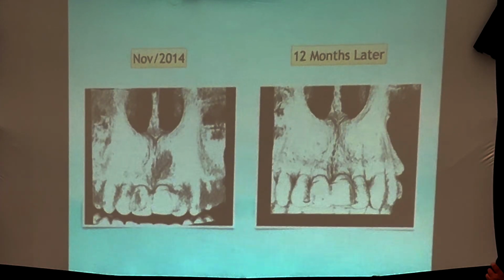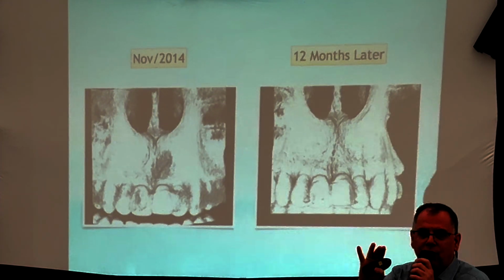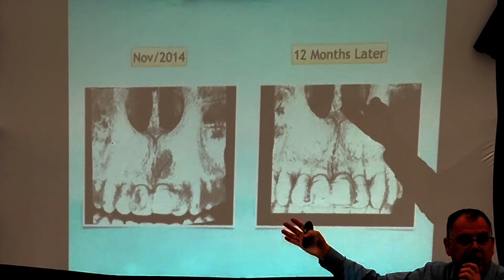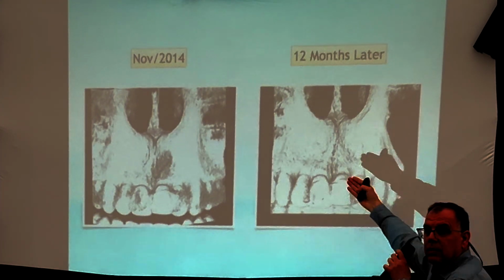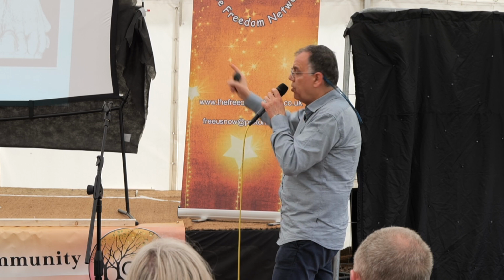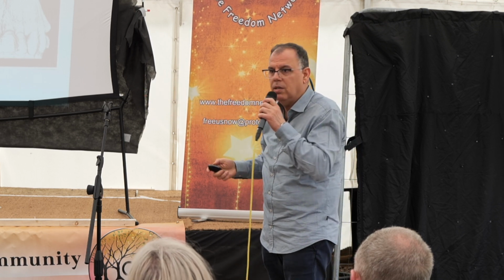Healed completely with the anatomical sagittal fissure. I don't know if you understand those words. It's the fissure, the line here. It's anatomy of the body. Natural anatomy. Came back with no opening, with no surgery. Sometimes I don't even use anesthetic because the laser is not painful at all. With just two applications of laser, 1 week apart, that's it.